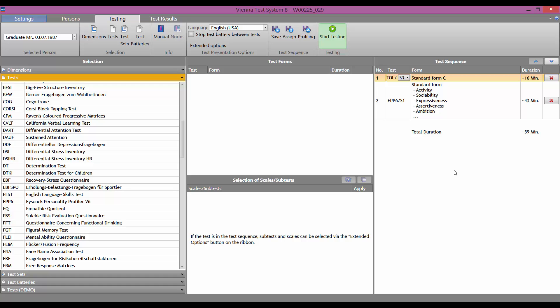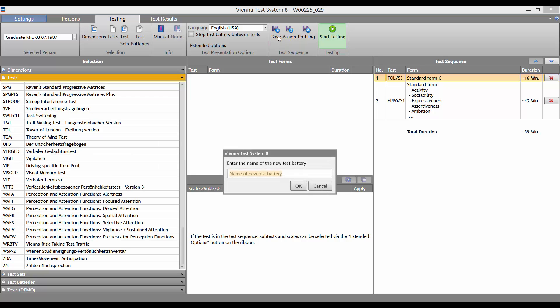You can then save your test battery, just click on Save, and enter a name for the test battery.